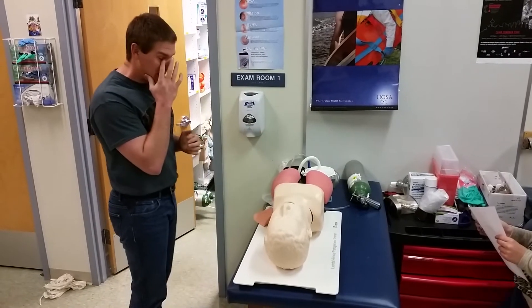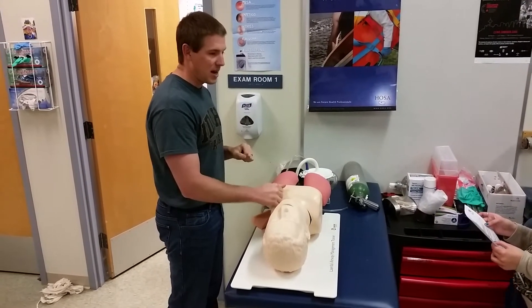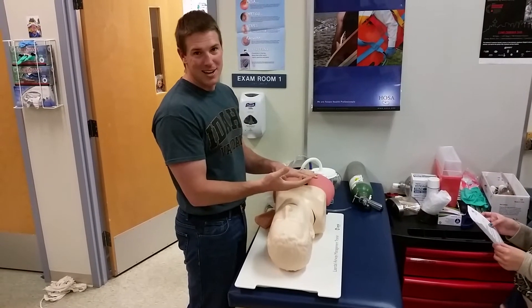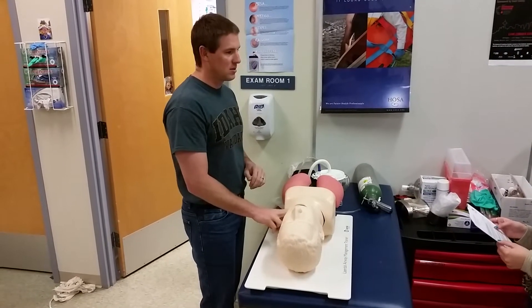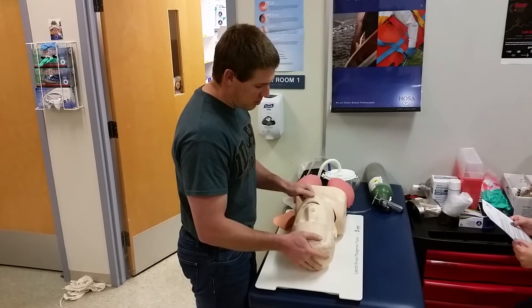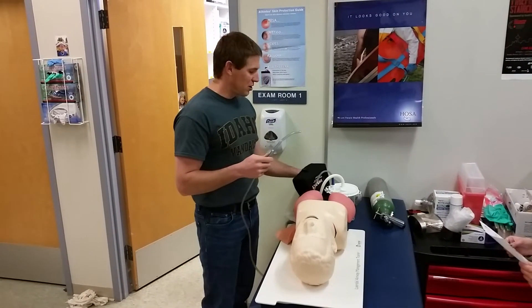When you get ready for the exam, you have an unresponsive patient. Come in and say: BSI, scene is safe. Check for responsiveness: 'Hey, hey, are you okay?' Check for pain response as well. Patient is unresponsive. Check for breathing for five to ten seconds — patient is apneic. Check for a pulse: there's a weak carotid pulse at a rate of 60. Call for additional EMS, then open and inspect the airway.